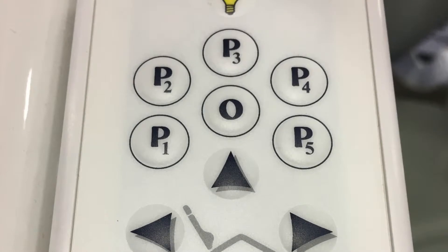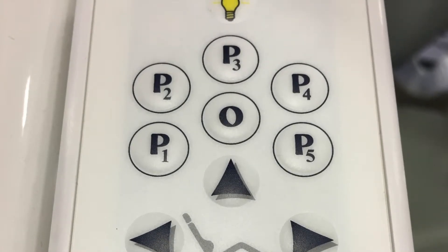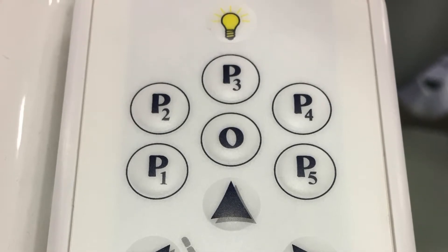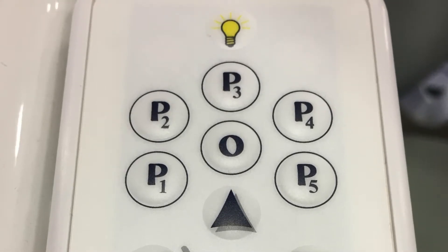The patient exit or zero button is used to program the patient exit position. Program the exit position using the same method as programming the P1 through P5 buttons.